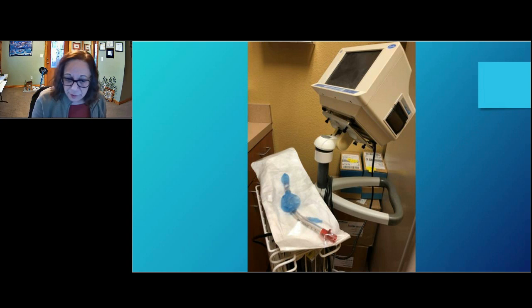I actually pulled it out so I could take a picture, but it was stuffed into this little side bin, all scrunched and mushed up. Personally, I would never use that on a patient, because I would not be assured that the endotracheal tube is still sterile after it was all smushed and pushed together, folded almost in half like a piece of paper, with the ends all smushed on the side. We threw it out, actually, and they replaced it with something that wasn't smushed.